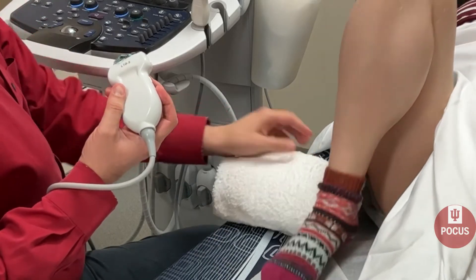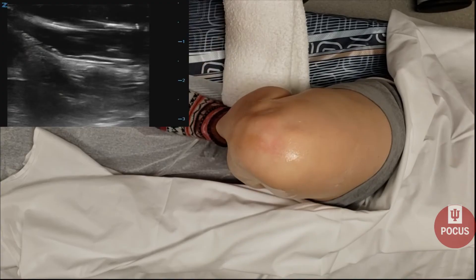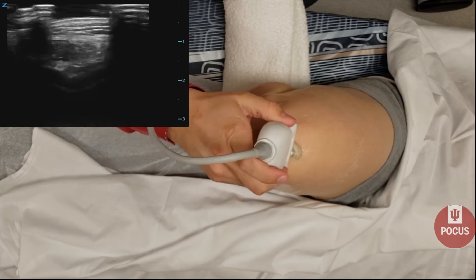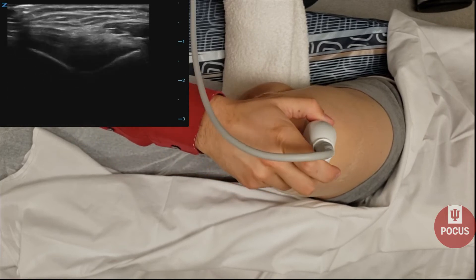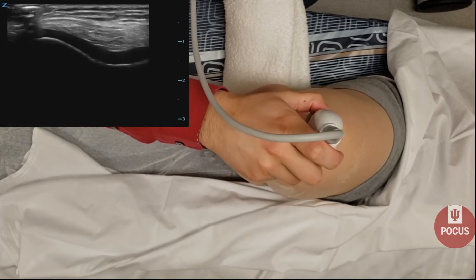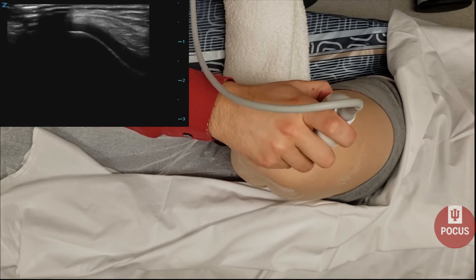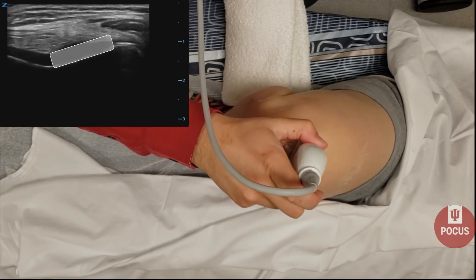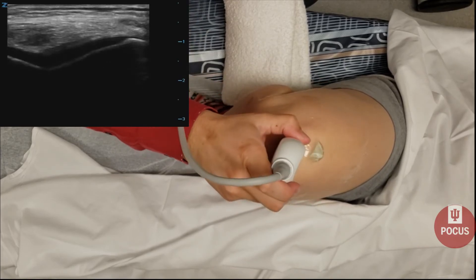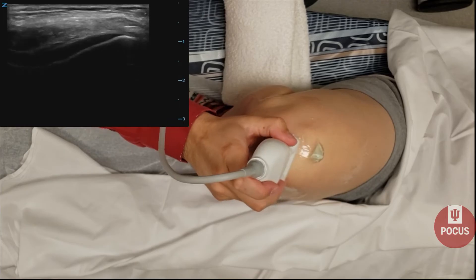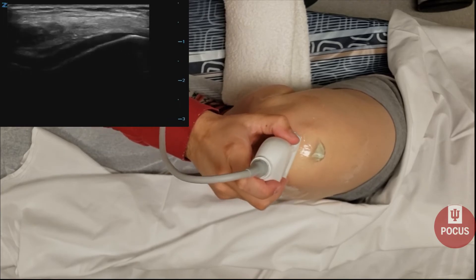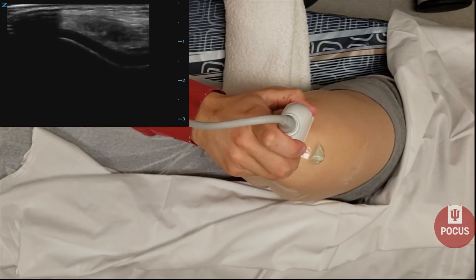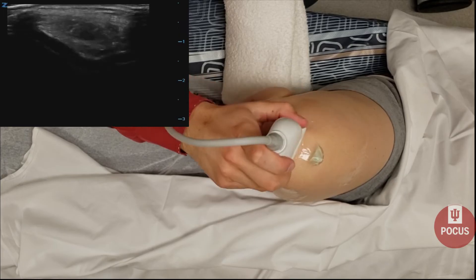Next, we'll want to look at our patient's knee in short axis and look at the joint line along the femur in transverse view. We can see the nice femoral cartilage in this patient. You can look for signs of cartilage thinning or a gouge in the cartilage, or signs of gout or pseudogout.